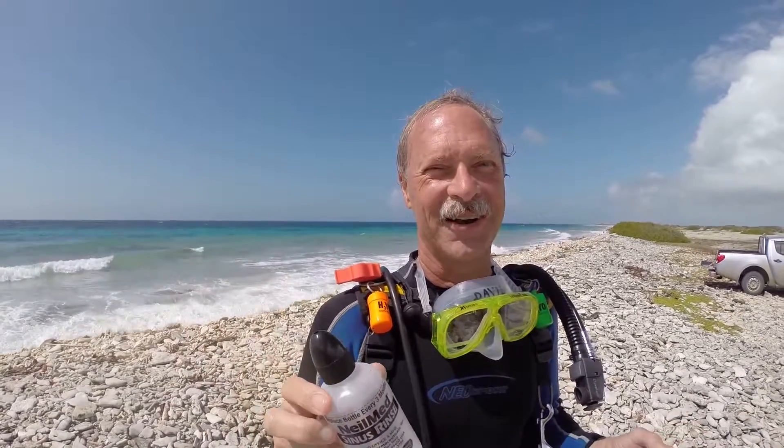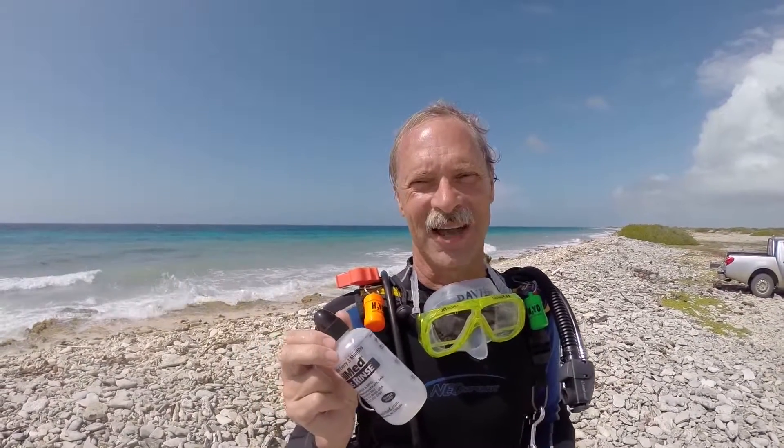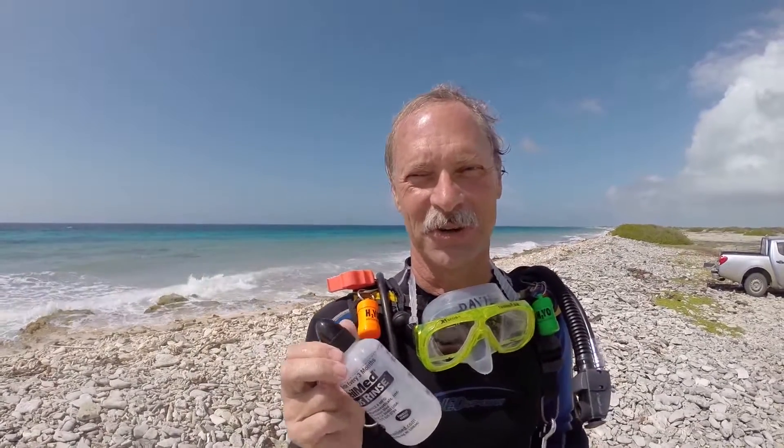Howdy, this is David Colbert. I'm down here on Bonaire, which is one of my favorite places to dive in the whole world, and my friend Doug is helping video this. I want to show you today how easy it is to use the sinus rinse irrigation system from NeilMed Pharmaceuticals.